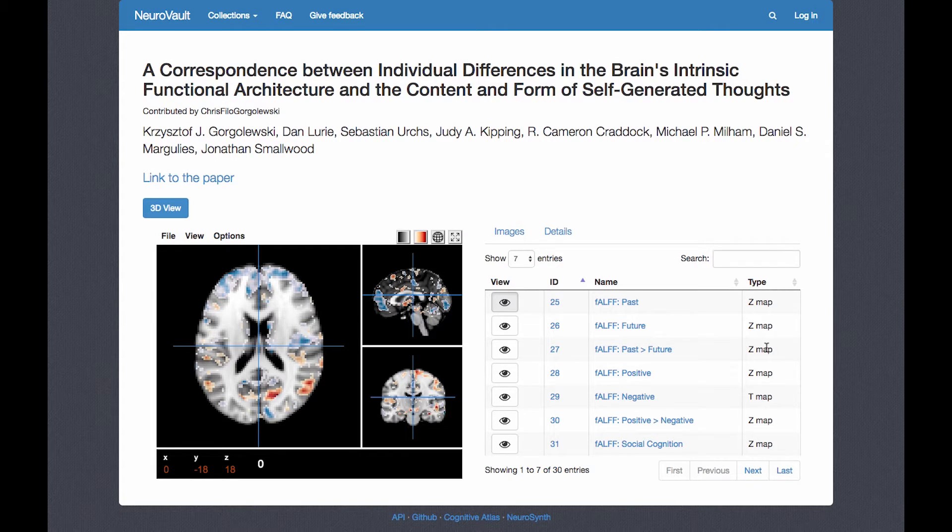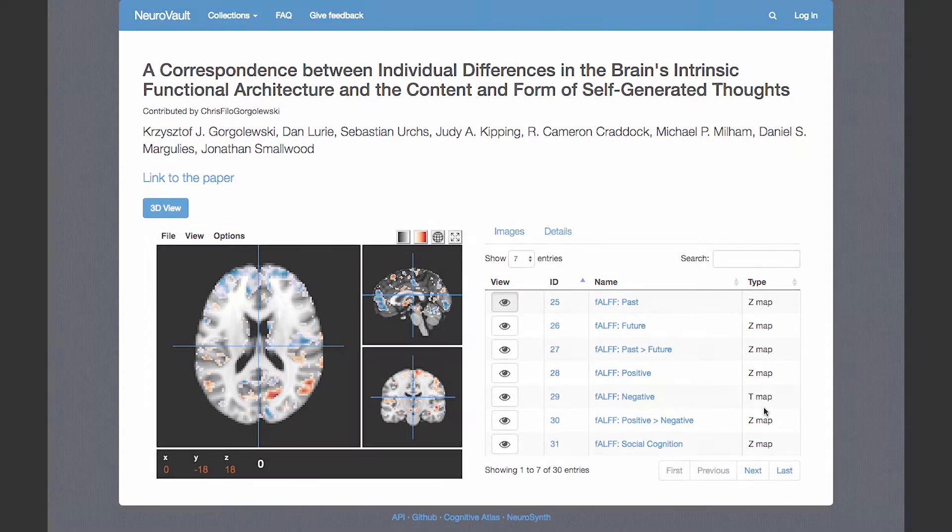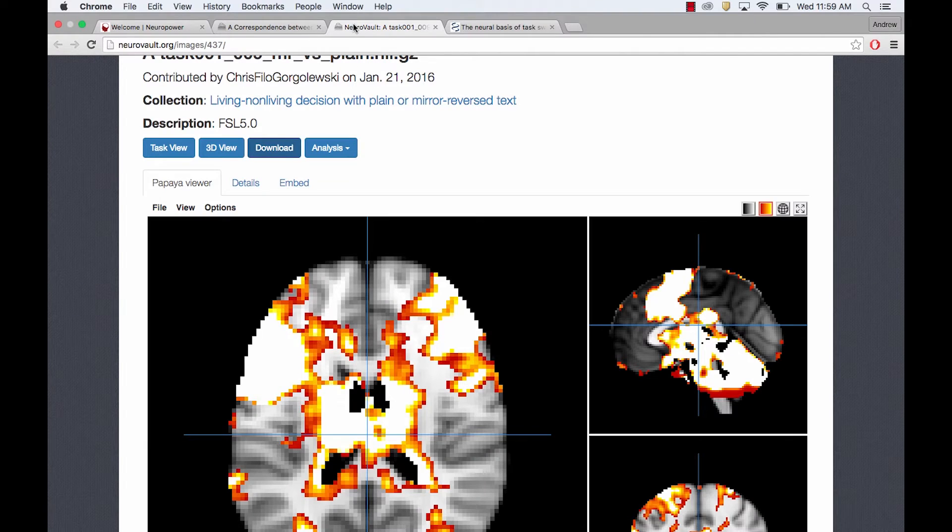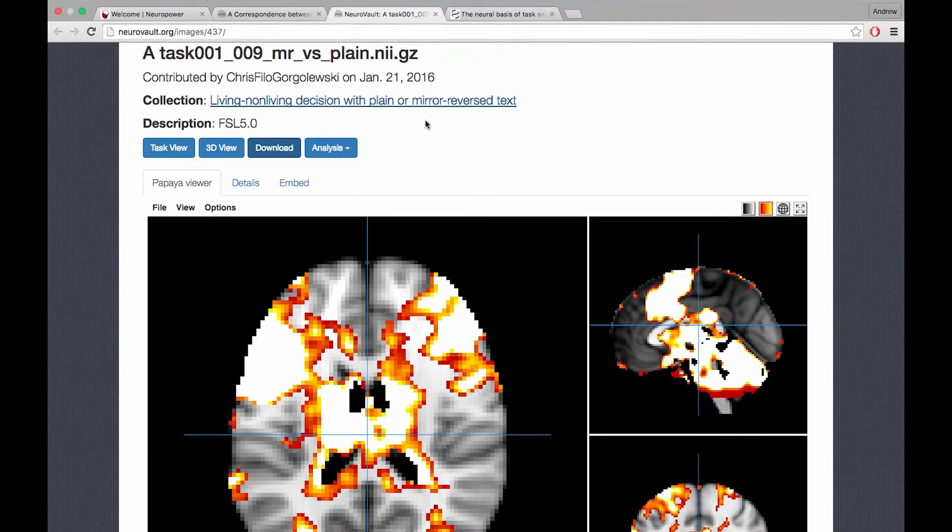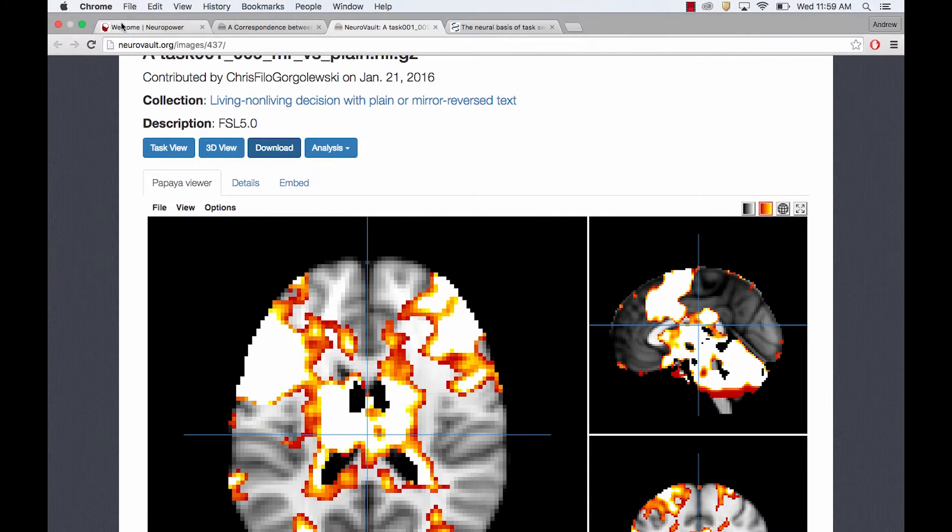Also note the type of map, either a Z-map or a T-map. For this tutorial, we'll be using a dataset from Russ Poldrax Group. Once you find something that you want to use, right-click on Download, click on Copy Link Address, and then go back to Neural Power Tools.